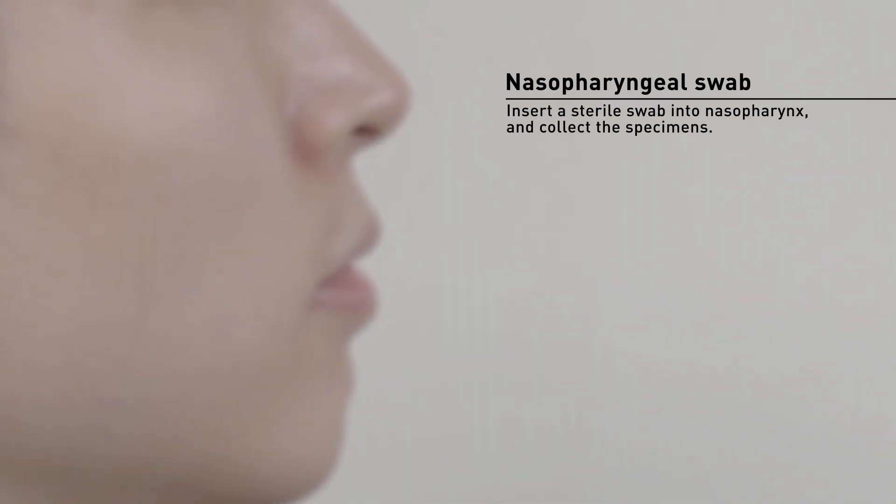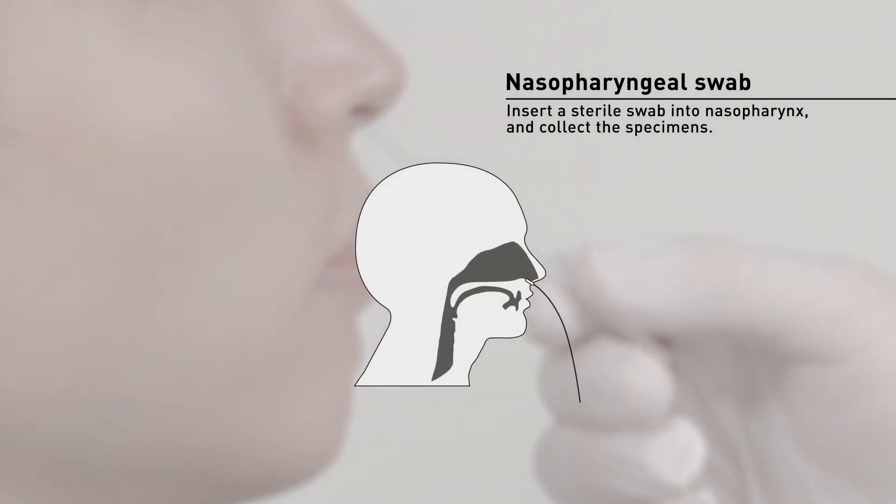Use a disposable swab to collect a nasopharyngeal specimen. Insert the disposable swab into the medial wall of the nasal cavity and swirl gently and deeply to collect a nasopharyngeal swab specimen.